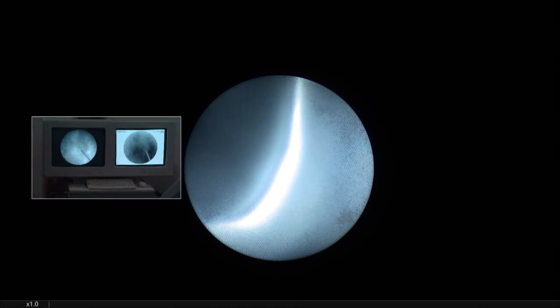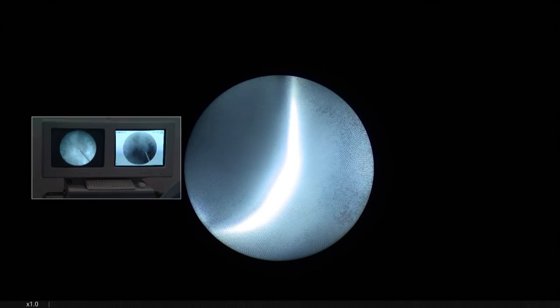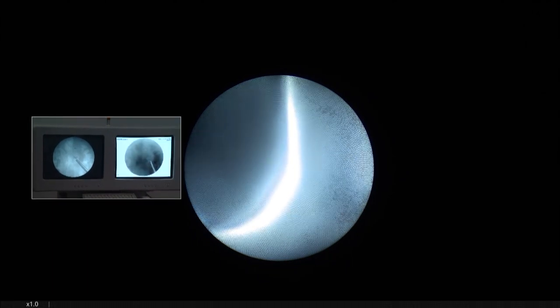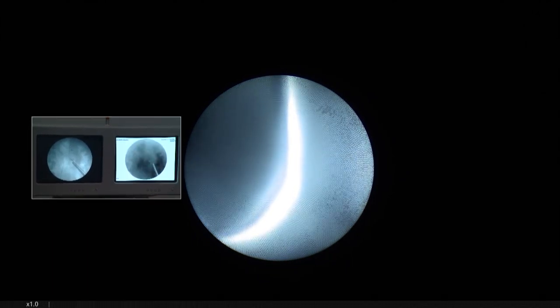Just another idea. We can force our way through this other calyx, no? But we cannot do it with this one. The Amplatz, it will break. Put some gel on the tip. When you had punctured the stone, did you feel the texture of the stone, please?